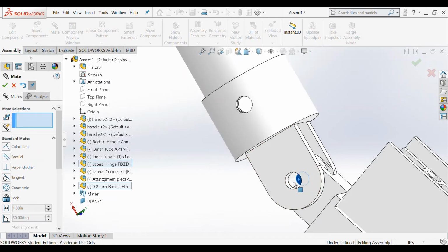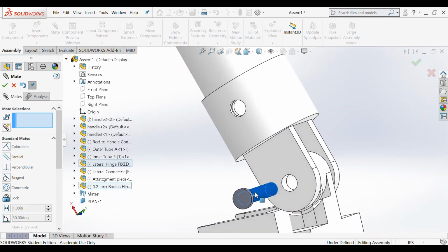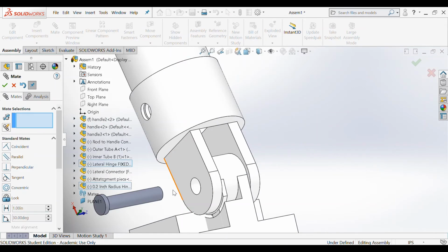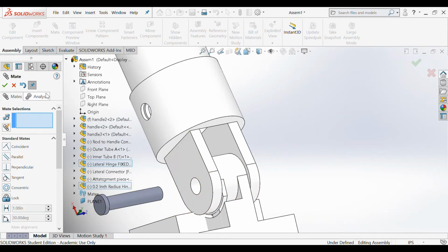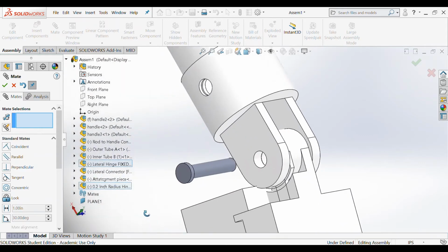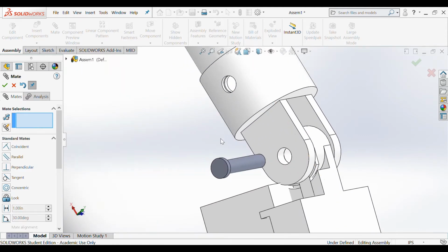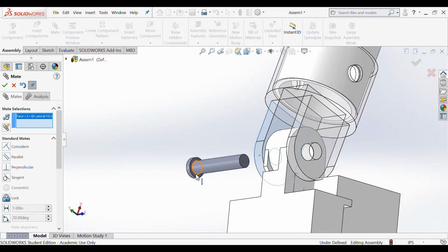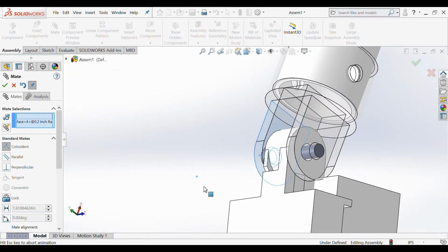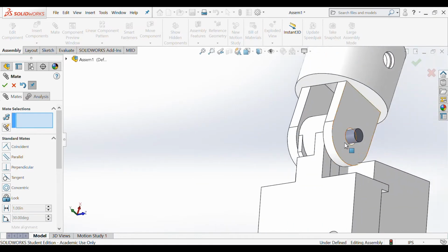And then I'm going to click on this and drag it around. Now I want this piece to be fixed inside this hole up against this surface. So I'm going to click on the outer surface of the hinge and this inner surface right here of the piece, and I'm going to make them coincident. So as you can see, I can't pull this piece out, but I can rotate it, which is why it won't be fully defined as well.